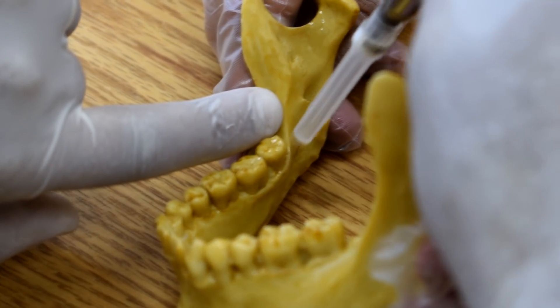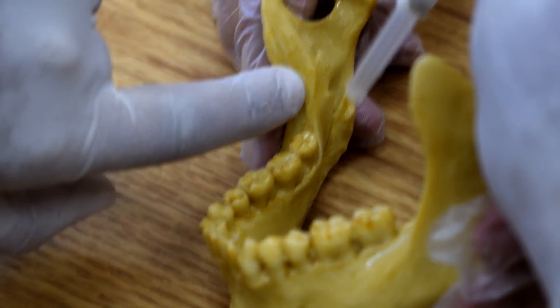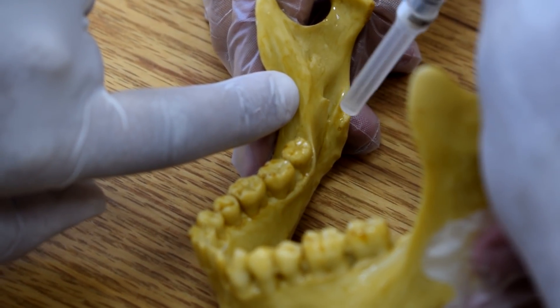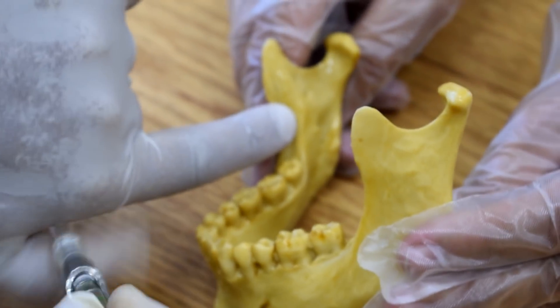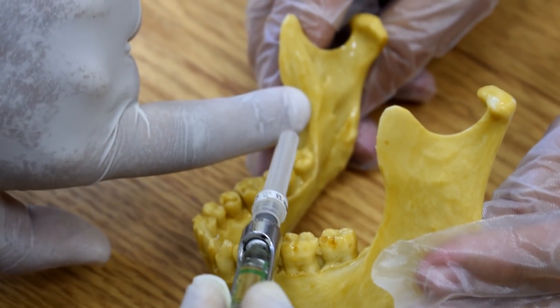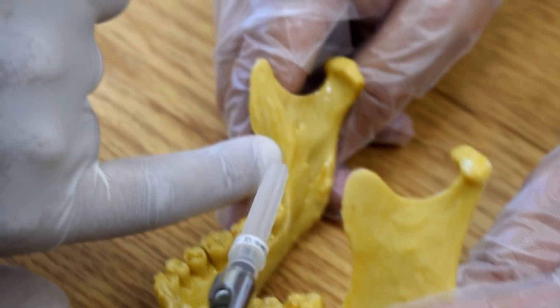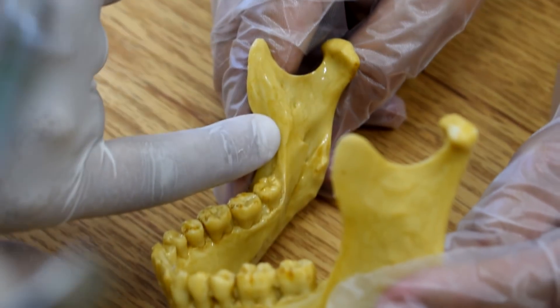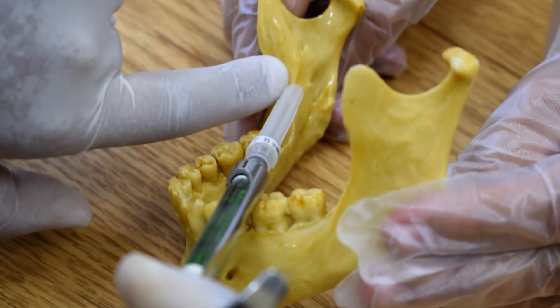Up to this point it will be horizontal, then here it will be vertical. I have to advance my syringe from the contralateral side, where it should lie over the contralateral premolars. While I am advancing, I have to take support and advance my needle.